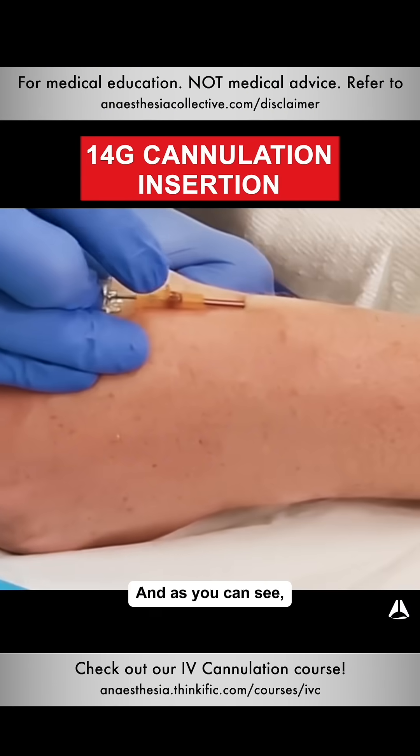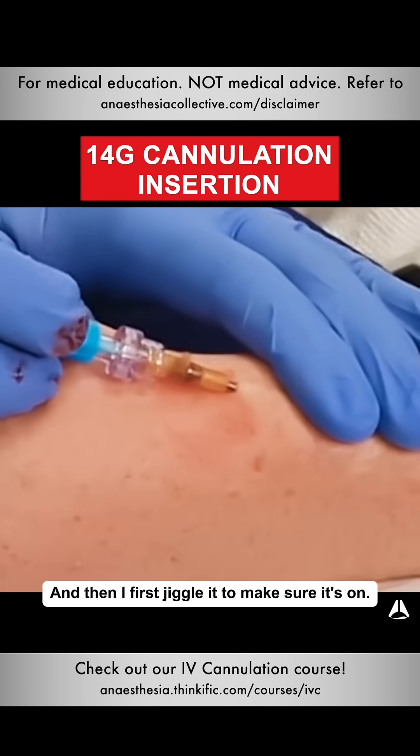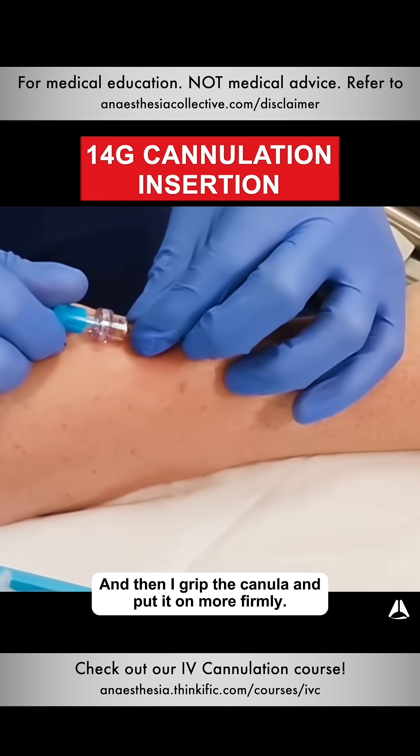I then feed off, and as you can see I get the secondary flashback. I then take my bung, put it onto the end, jiggle it to make sure it's on, and then grip the cannula and put it on more firmly.